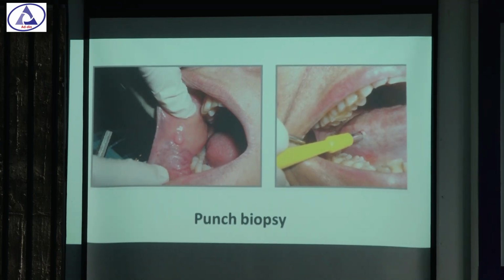Then there is punch biopsy. We can see that in punch biopsy, there is a punch needle from which we can take out very small lesions.